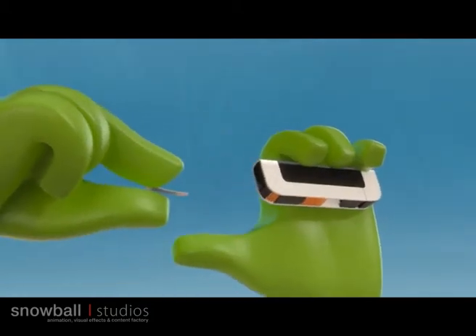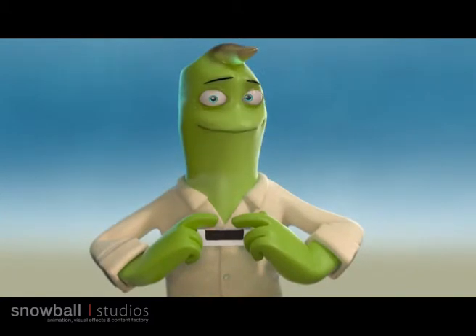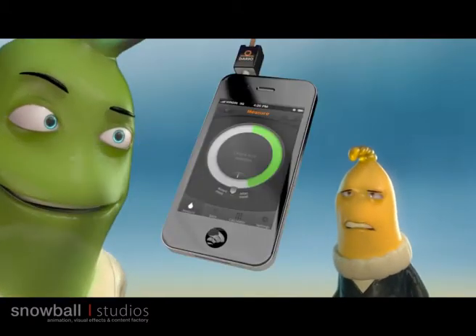Pull the strip out of the strip exit port and place it inside the meter. Now, are you ready for the real thing? Load the lancet, place your finger here and press here to activate the sterile lancet. Just put your finger on the strip and wait a few seconds.